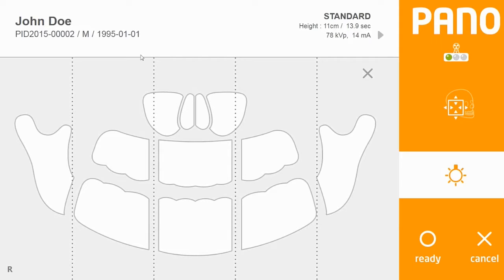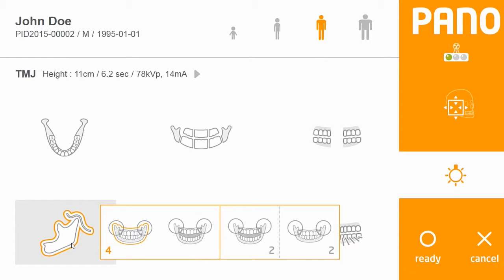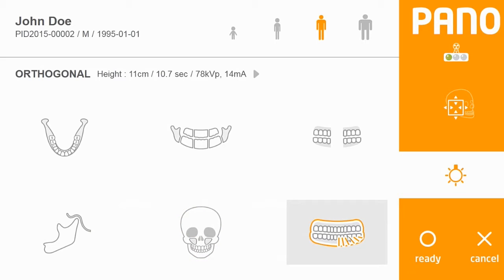If you do not need the TMJ, click to gray that out, and the machine will still do the full rotation around the patient, but it will only radiate the areas not grayed out. To the right is the external bitewing option. Below the standard panoramic option is a two-dimensional TMJ acquisition, which lets you take one or two rotations around the patient — scanning the patient's right and left joints open and close. The next option gives the two-dimensional sinus. To the right of that is the orthogonal panoramic option, which makes a slightly slower rotation around the patient's teeth, does not capture all of the TMJ in the image, but does reduce some of the overlaps in the image.